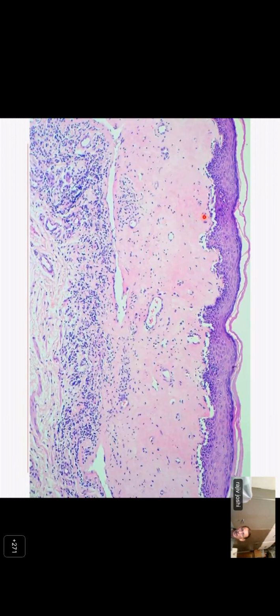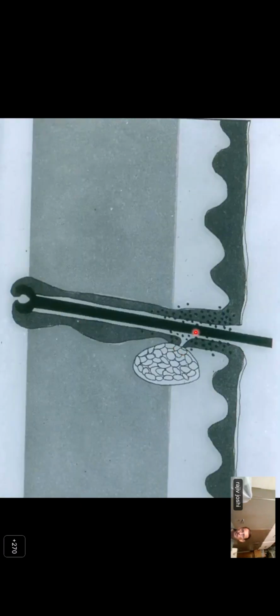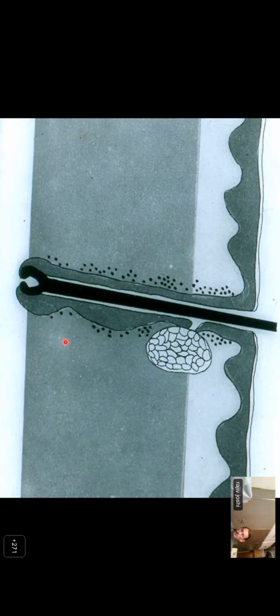On the other hand, this is hyalinized sclerosis. So this is typical lichen sclerosus, where you get hyalinization of the upper dermis and a band-like infiltrate of lymphocytes at its base. So there's a difference between fibrosis and sclerosis. If you see sclerosis, there's a whole group of diseases which is different from that what you see in fibrosis. So this is sclerotic collagen, acellular generally, absence of adnexal structures, and this is typical of lichen sclerosus. Then you get folliculitis and perifolliculitis.